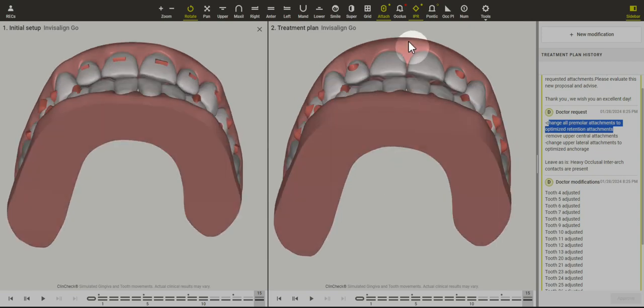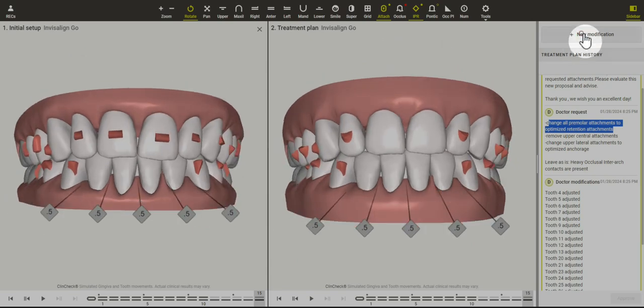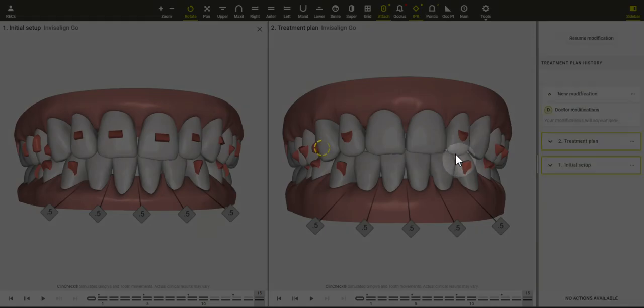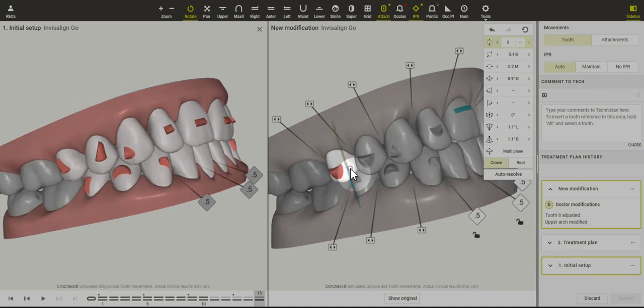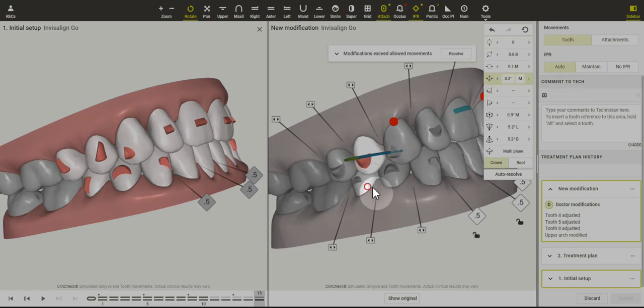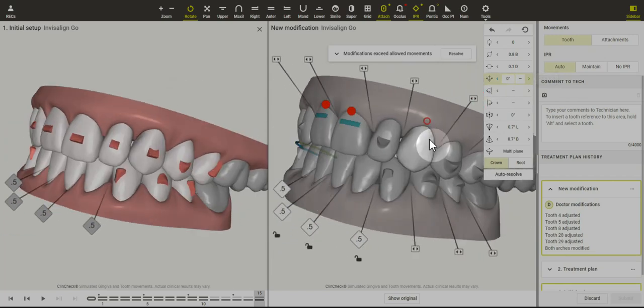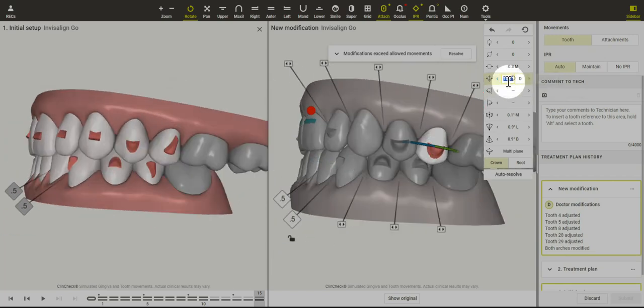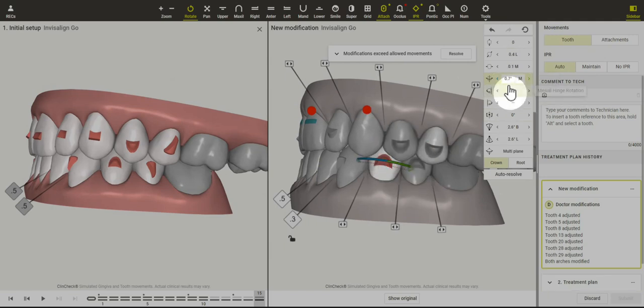These teeth aren't quite straight, so let's do a last modification to make the upper incisors more level with each other. I'm going to click on this tooth and just type in zero. You could write to the CAT designers and say 'please eliminate all premolar rotation' — that's another way to go about it — but for demonstration purposes I'll just take care of that here.